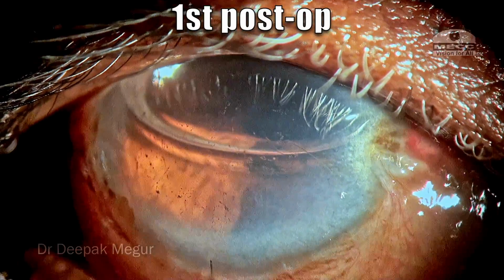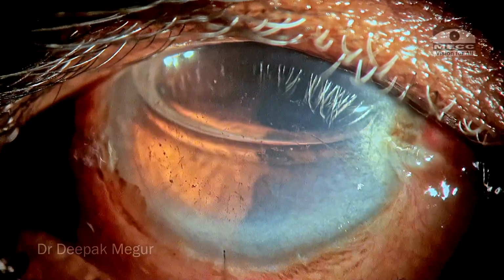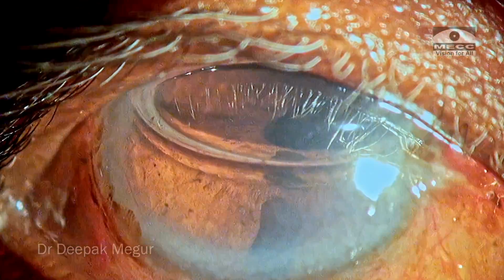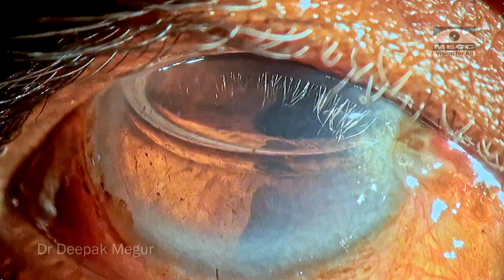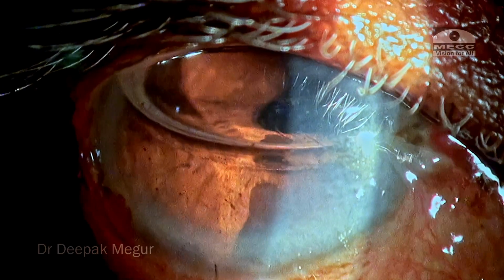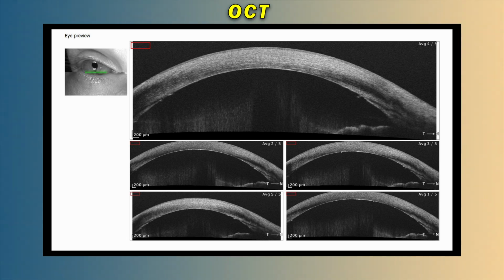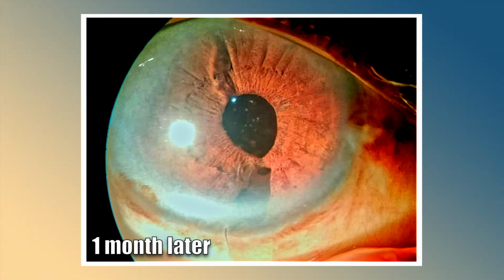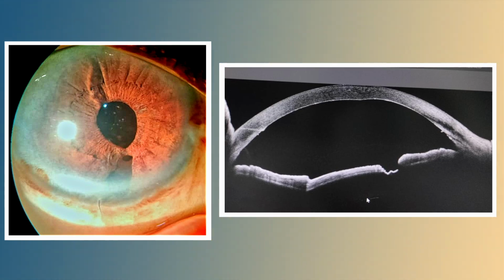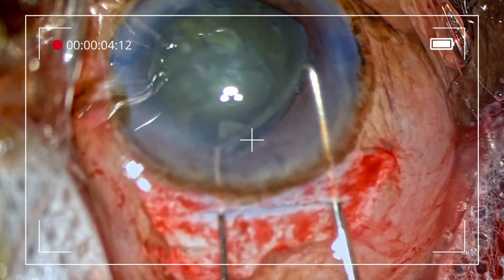And these are the first day post-op pictures, and the inferior cornea has cleared. We can see the gas bubble size has shrunk. It's about 3/4 fill of the chamber now. Nevertheless, we are going to ask the patient to maintain a supine position for as long as she can, so that we don't have any redetachments. And these are the OCT pictures. For a couple of weeks, the gas bubble decreased in size, the Descemet membrane remained attached, and the cornea is clear. To summarize, video reviews are a great way to analyze where things went wrong.